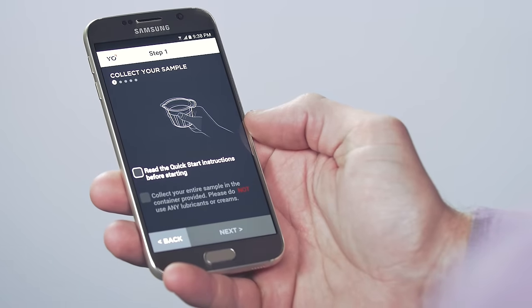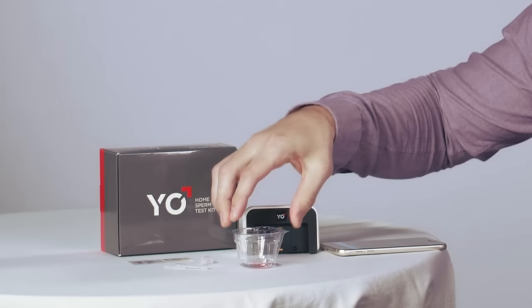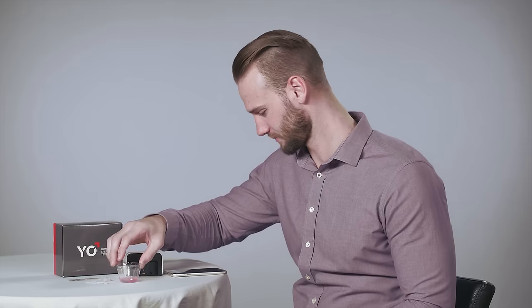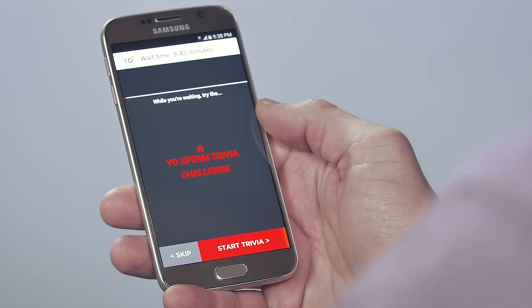To start, collect your sample in the collection cup provided. Then add one vial of liquefying powder and gently mix for 10 to 15 seconds. Your sample will turn slightly pink. Let your sample rest for 10 minutes, and while you wait, why not take the Yo! sperm trivia challenge?